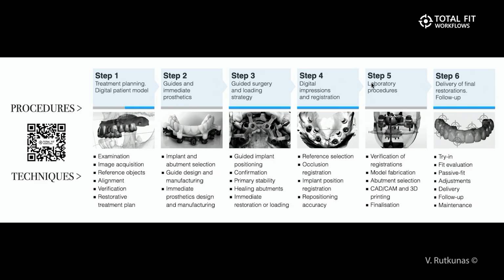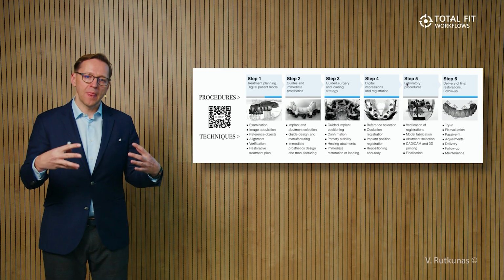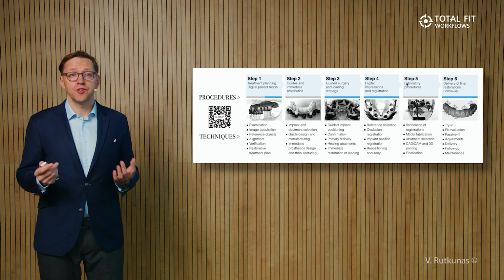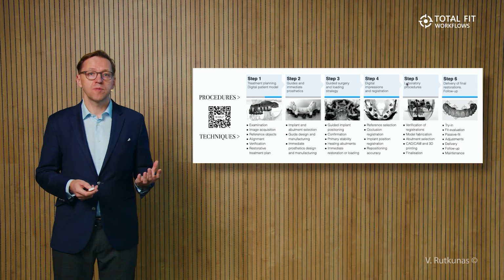The lab procedures also have to be organized to maintain that level of accuracy that we obtained at stage 4, and then stage 6 is delivery of the final restorations. And the aim nowadays is to deliver the final restoration without try-in appointments. Is that always possible?